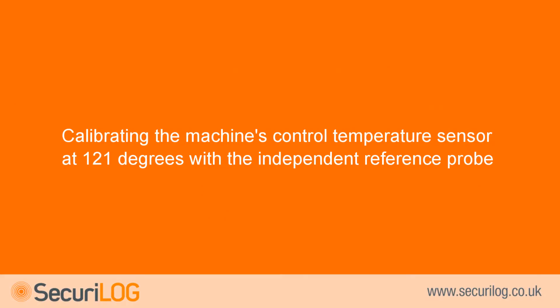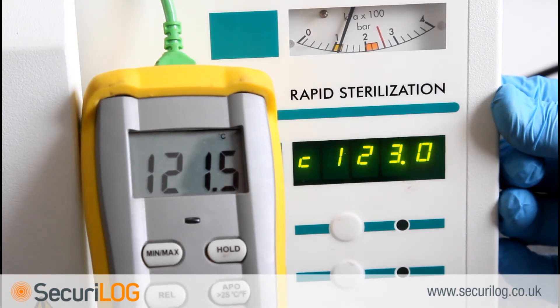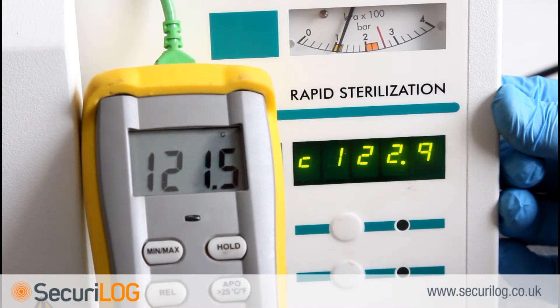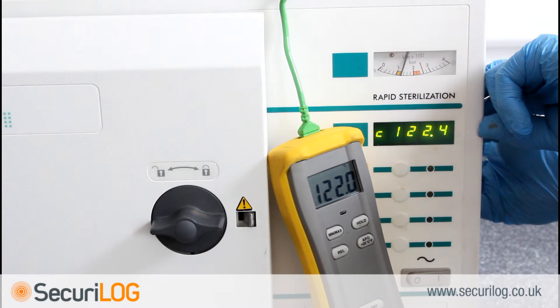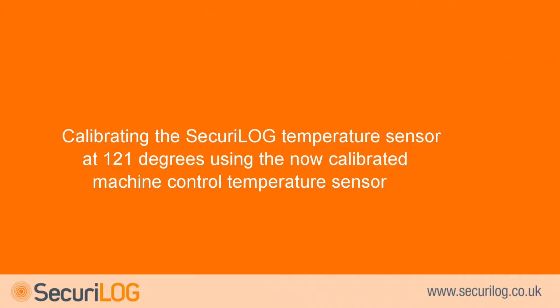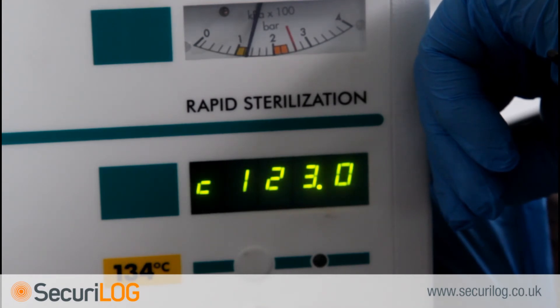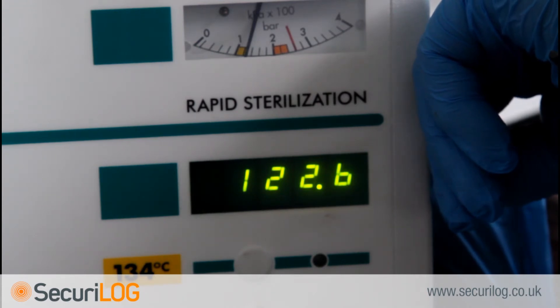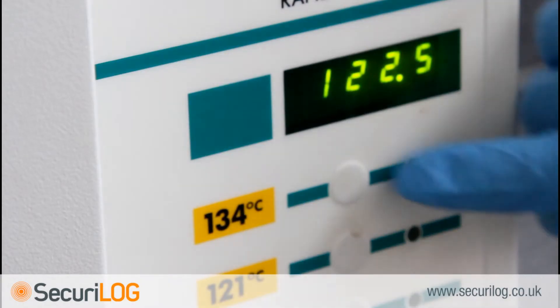Calibrating the machine's control temperature sensor at 121°C with the independent reference probe: after 5 minutes, check the steriliser control probe against the independent reference probe by pressing button 5. The display will show 'C' indicating the control probe value. Continue to hold button 5 and, using the trimming tool, calibrate POT R17 on the main board until the control probe value indicates the measured value from the independent reference probe. The Securilog probe can now be calibrated at 121°C using the now-calibrated control probe value. Switch between the control and Securilog probe values by pressing button 5. Use the trimming tool to calibrate POT R9 so that the Securilog probe reads the same as the control probe. When the 121°C cycle has been calibrated successfully, press button 1 until a beep is emitted.